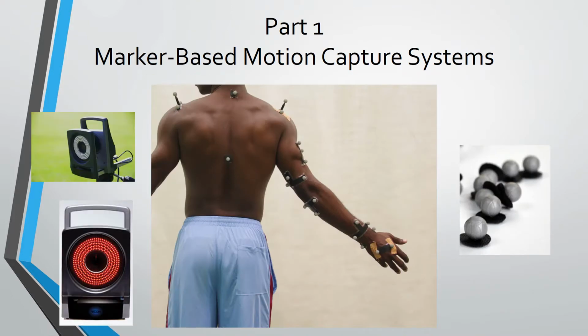So, how our main cameras work is that they don't record visible light, as in video, they actually record infrared points. Now this infrared is initially emitted by the strobe, which is this circle configuration of LEDs surrounding the lens of the camera. So the strobe emits the infrared, and then it is reflected by these special markers which are placed on the participant and reflected back into the camera where it is recorded.